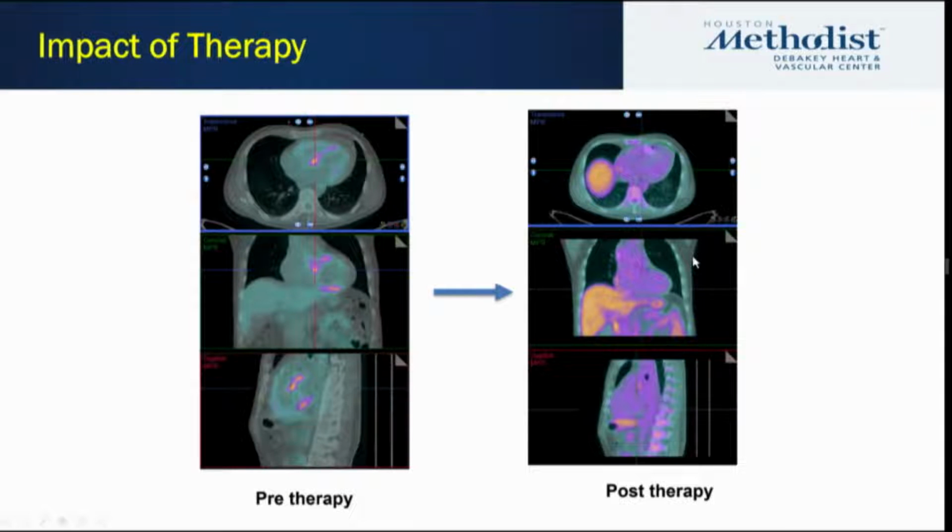So this is another common use of cardiac PET, now looking at different cardiomyopathies and trying to characterize whether these are active inflammatory cardiomyopathies or old scarring from these prior involvements. And I thank you very much.